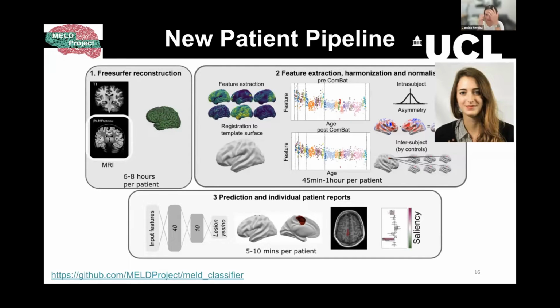Okay, so basically, just to summarize, if you have multiple sites, do the harmonization within site first, and then harmonize all of them again, or just no. So within site, if you had multiple scanners, the way to do it would be to have a different site code per scanner. So you just know that it's come from scanner 1 or scanner 2, and so on. Perfect. Got it. Thank you.